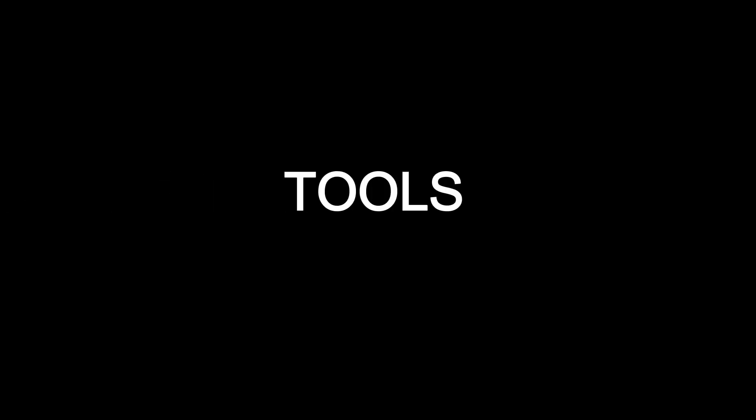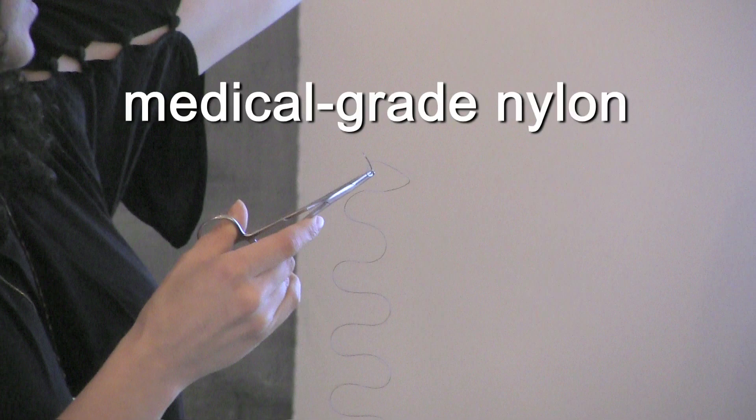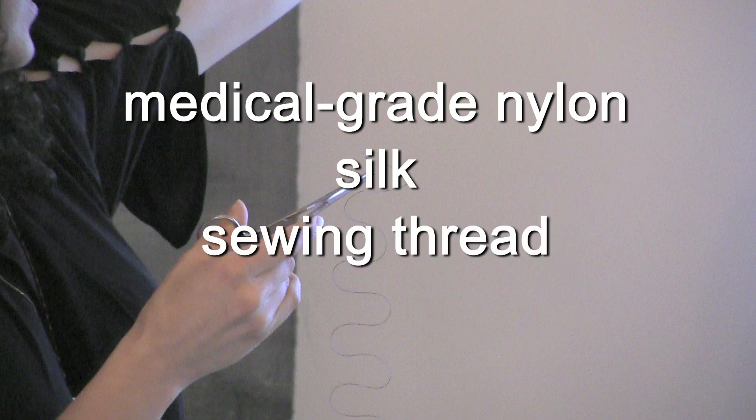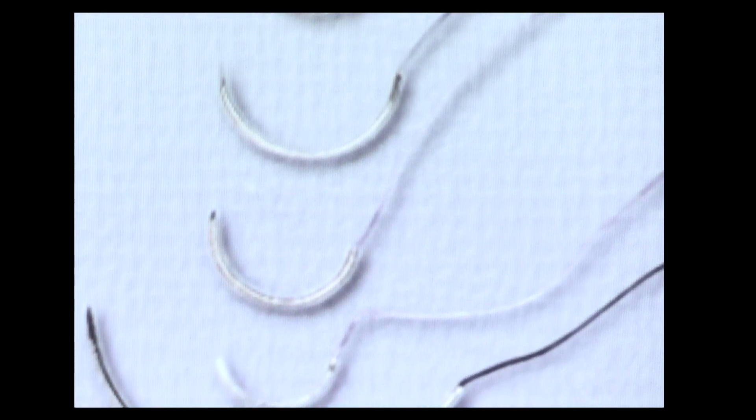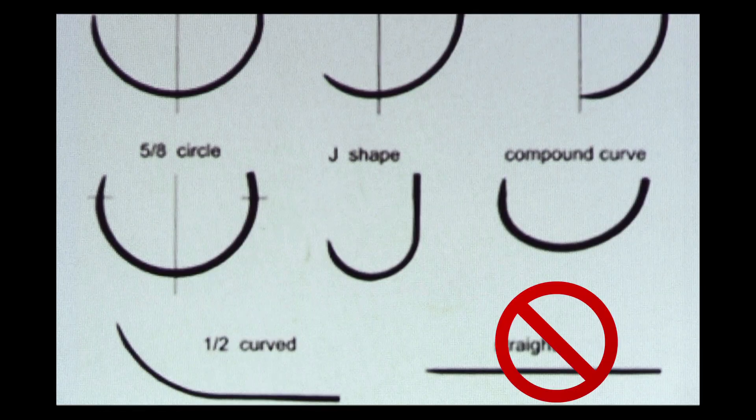But first, your tools. You'll need suture material or thread — it should be medical-grade nylon or silk, but if you need to use your sewing kit thread or dental floss, just make sure it's as sterile as can be. Then you'll need a needle — it should be curved. You could use a straight one, but it'll hurt like hell.